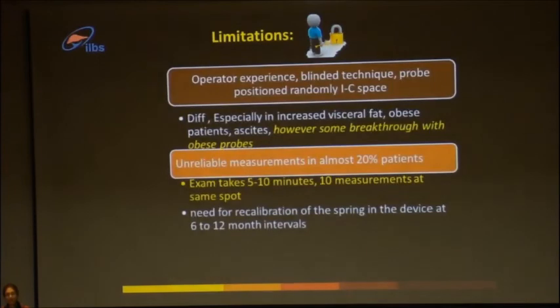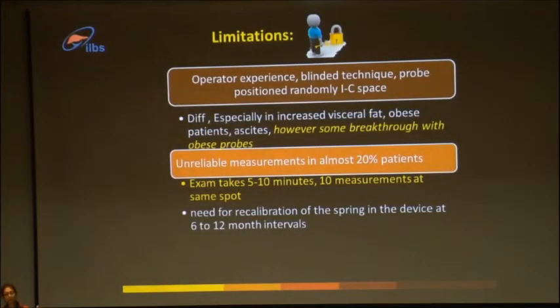Like I said, many limitations. Operator experience is the most important. It's a blinded technique. You don't know where the probe is being put in. It's difficult in increased visceral fat. So if a patient has a thick abdominal wall, is obese, has ascites, there has been some breakthrough with the XL probe, and they are coming up with advanced technologies with that.